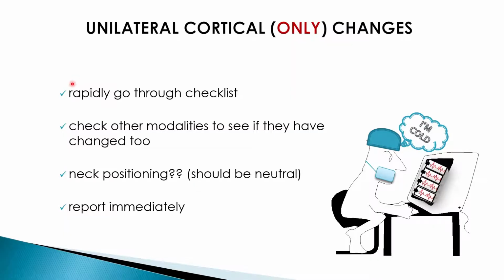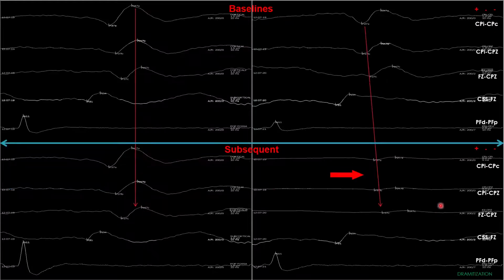We already went through the checklist. We looked at other modalities. We checked the neck position, and we report this immediately. If this is a vascular case, then this is something that probably should be immediately addressed.